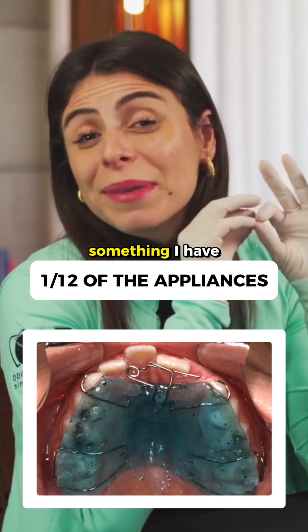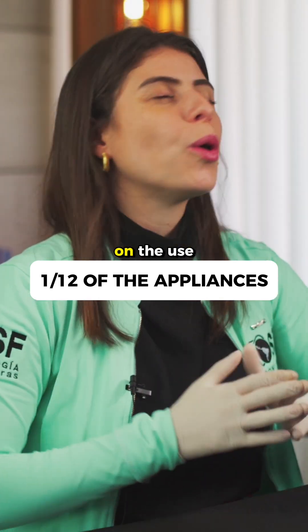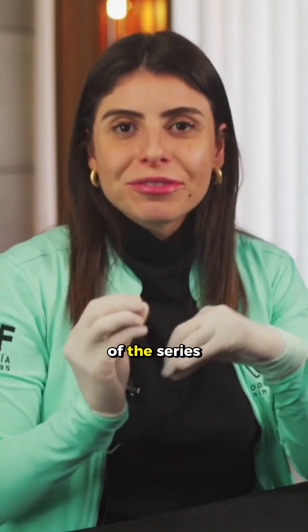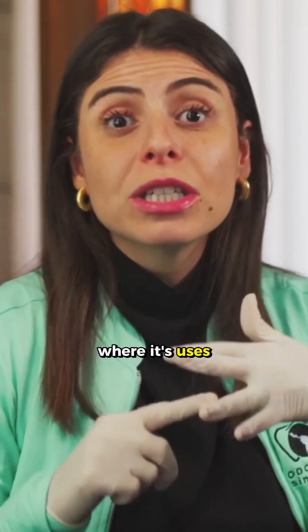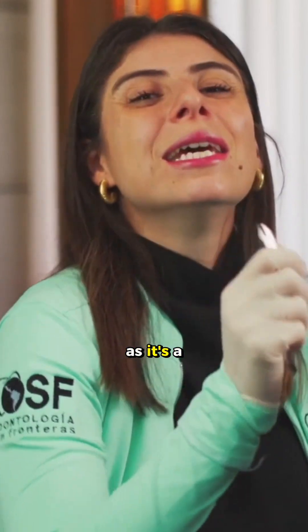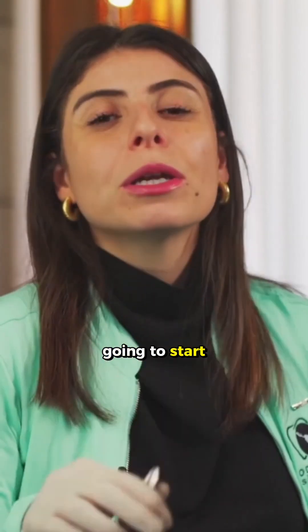Today we are going to start something I have never done before, which is a series of explanations on the use of 12 different appliances. Each day of the series I will show how the appliance works, where its use is, the application. We will handle the appliance, we will activate the appliance. So get ready, as it's a sequence of 12 appliances in a row.